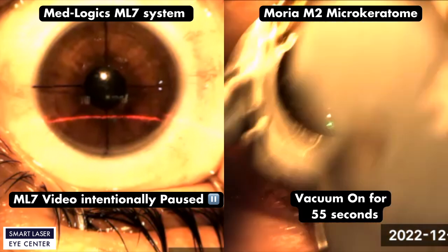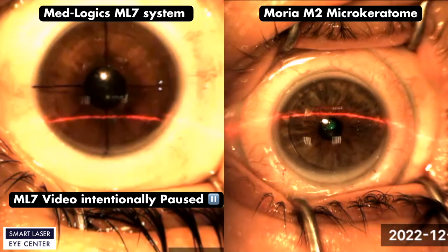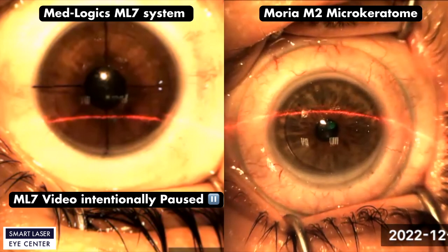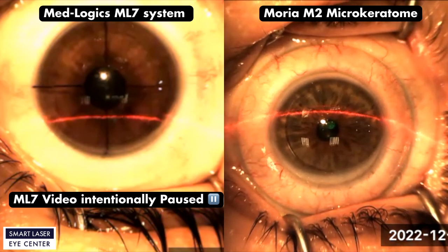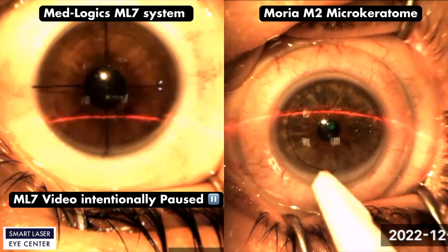Vacuum off and the eye ring is released gently. If you look at the left side ML7 video, there is no sign of subconjunctival groove outcome. Also there is no gap between cornea and flap edges. On the right side, the M2 vacuum ring created a deep round groove on the eye due to elevated vacuum along 55 seconds.